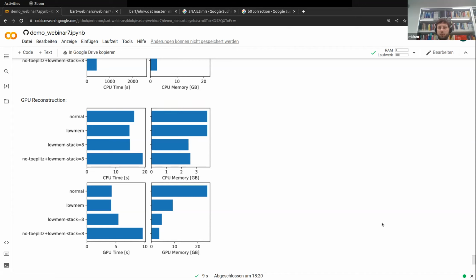And for computing the median of the gridded image, all the pixel values are sorted using quicksort. And in my measurements, that was the main reason for a long waiting time in the initialization.